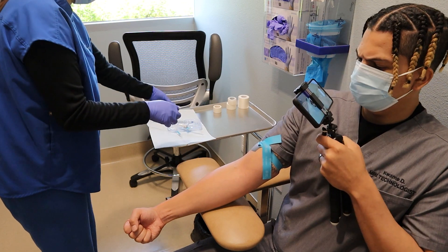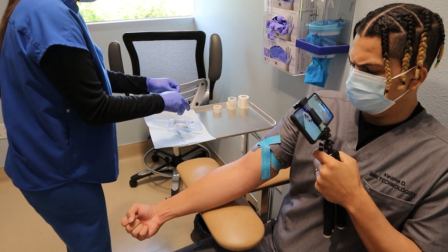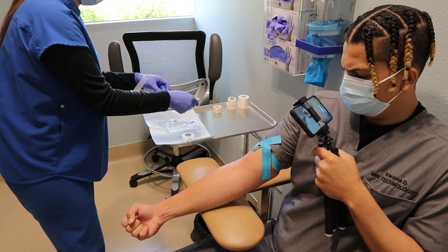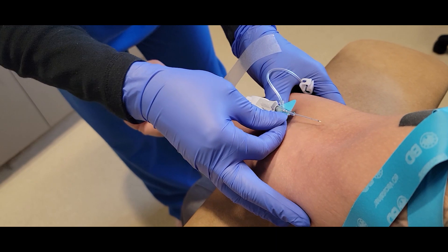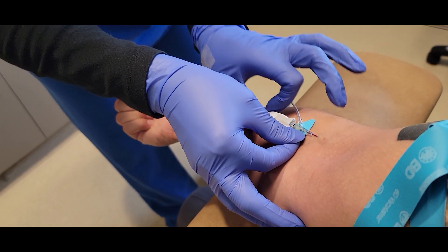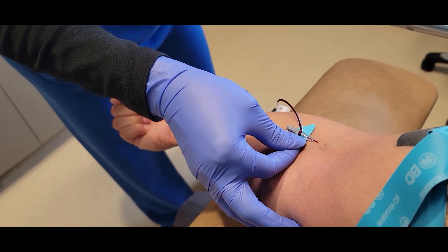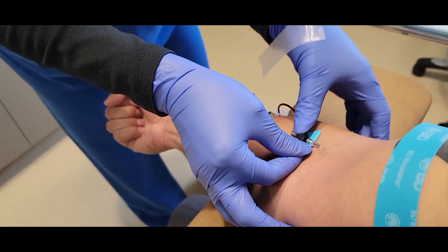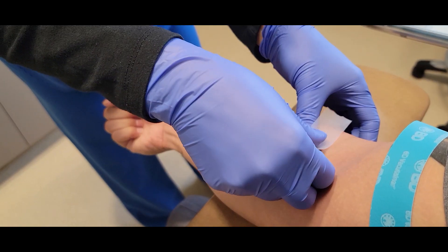And here I'm getting my tape ready. You want to have your tape ready before you go in just because you're going to have to tape that catheter down. And I have my catheter here, I'm going to go in just below where I see the vein. I always like to go below where the vein is most visible or palpable just because I know I have to advance my needle quite a way.